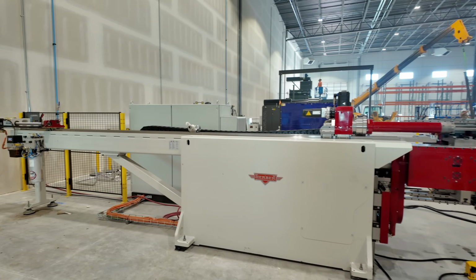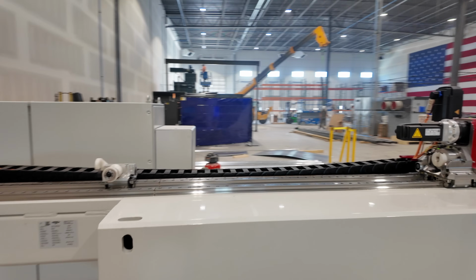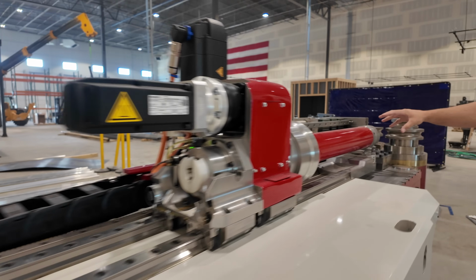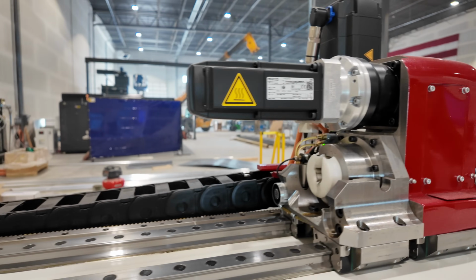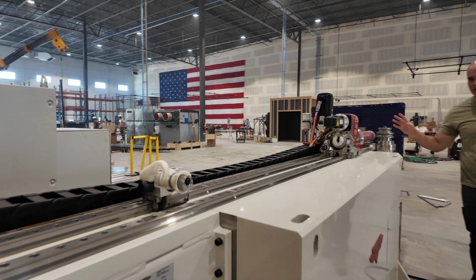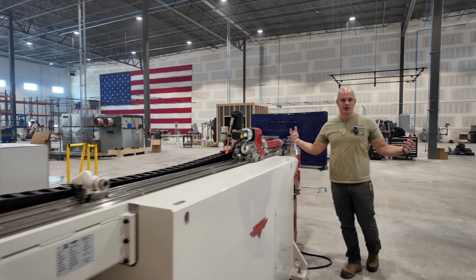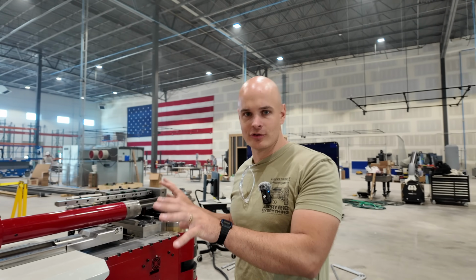With that, a really nice introduction. Let's start taking a look around some of this cool equipment. It is an active zone, so we'll be careful, and it is a little loud. Let's start with this machine right here. This is a Herber 350 LR bending machine. It's a mandrel bender. We can take a 20-foot stick of aluminum and put it in this chuck at this end, and then this whole mechanism moves back. It can bend a whole wheelchair within about a minute or 2. It's so powerful and so fast. This machine costs about $450,000.